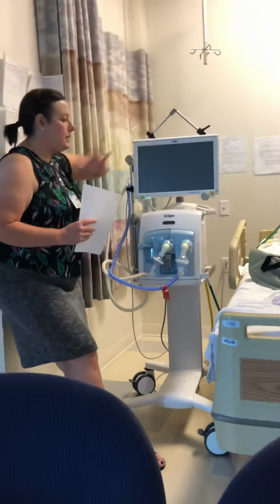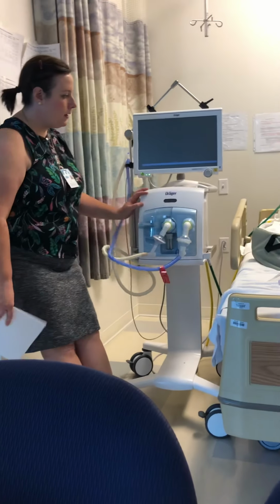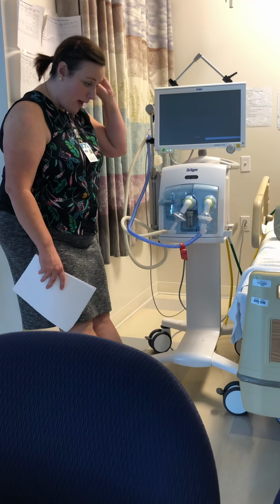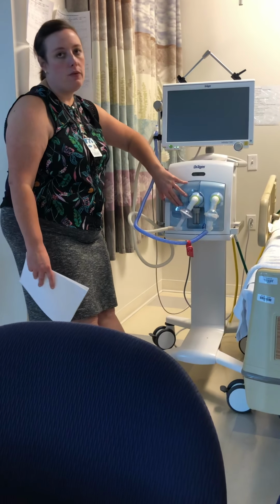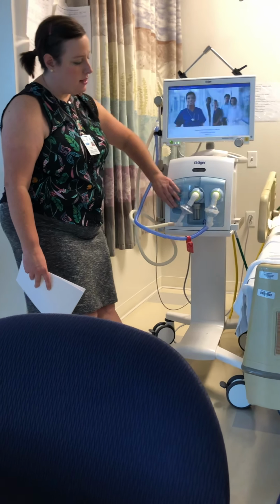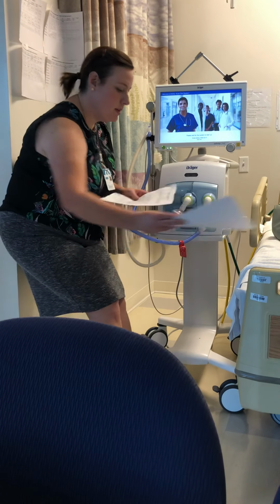You'll get it just like this. So you'll have to turn it on, which is this green button. It's not an arrow at all. It does its whole setup. If I can find the actual Neo expiratory valve, I'll have you do the check off, which if I don't find it by next week, we won't do it at all, but we're having no such luck finding the Neo expiratory valve at this current moment in time.